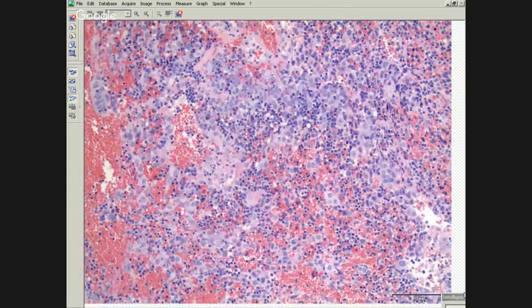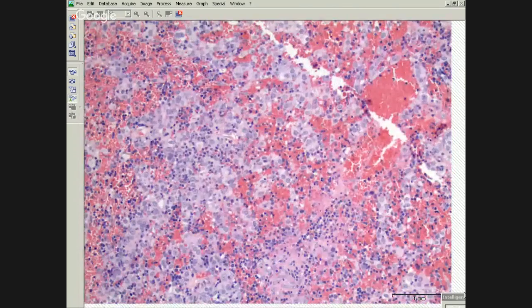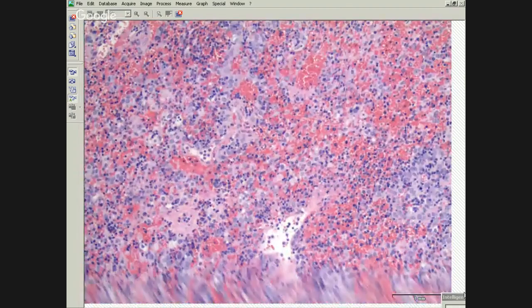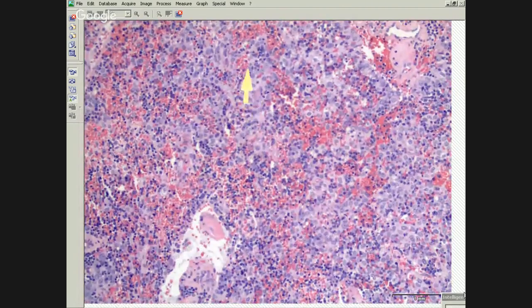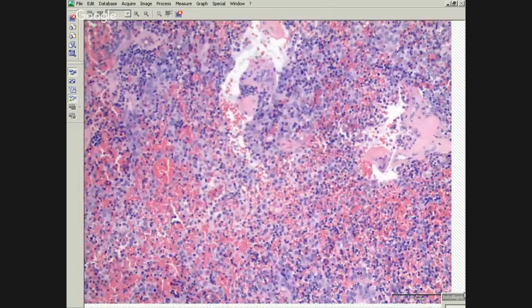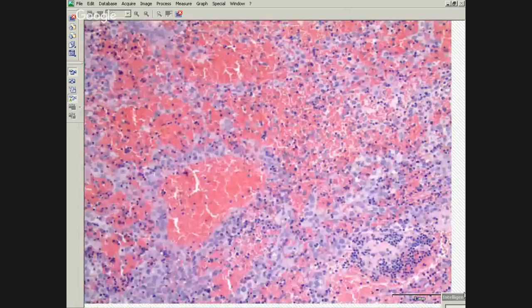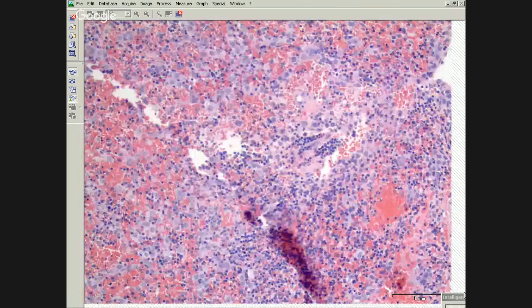So this one will be P63 positive? Usually they are. That's more common in thymic carcinomas than thymomas. Sometimes these will pick up some CD5 staining as well. But essentially you'll have keratin positive cells with the CD3 positive lymphocytes in the background, and then you need to pick up the phone and talk to your clinician. And they'll be like, oh yeah, that's what we thought.